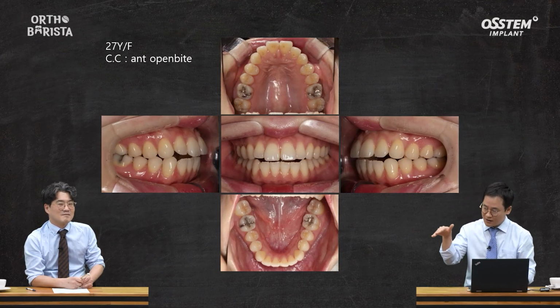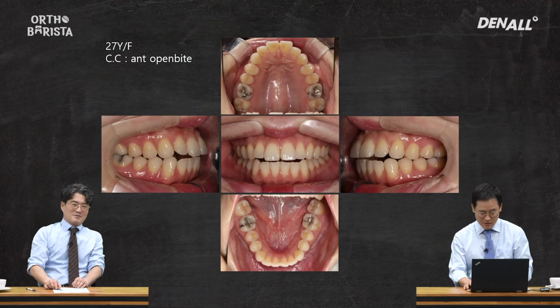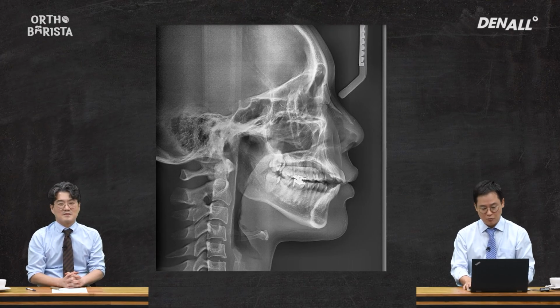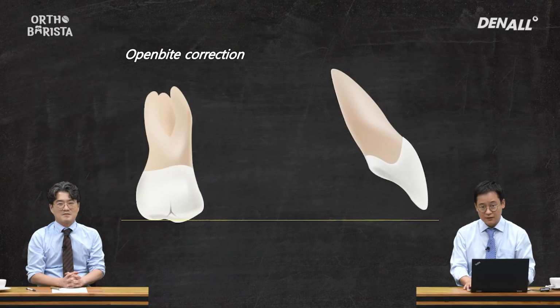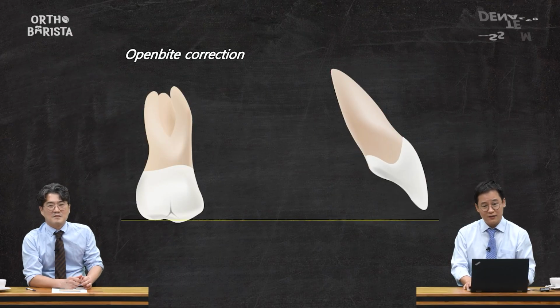In this case, the anterior teeth were actually distalized with slight extrusion, which is a great outcome. So, I proceeded with the treatment. Based on a panoramic X-ray, I could see that this wasn't a severe skeletal open bite. First, let me clarify here. I think that distalization mostly accompanies extrusion.